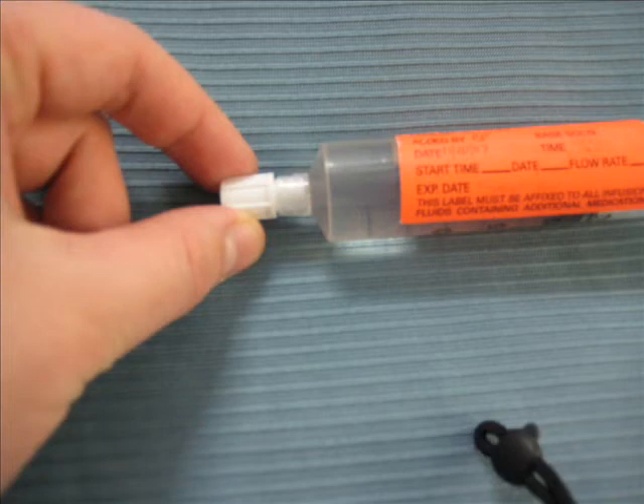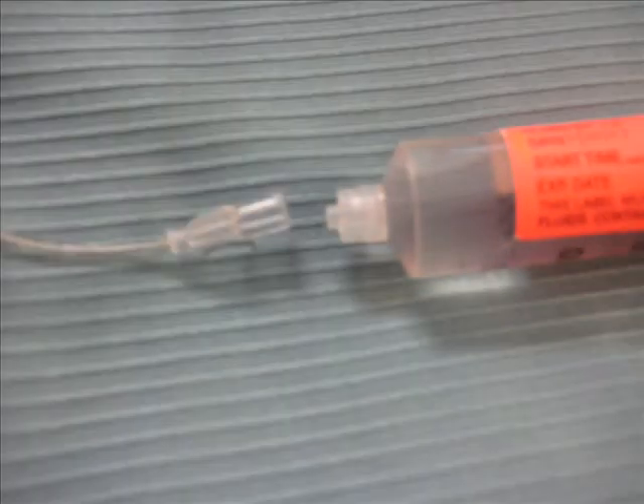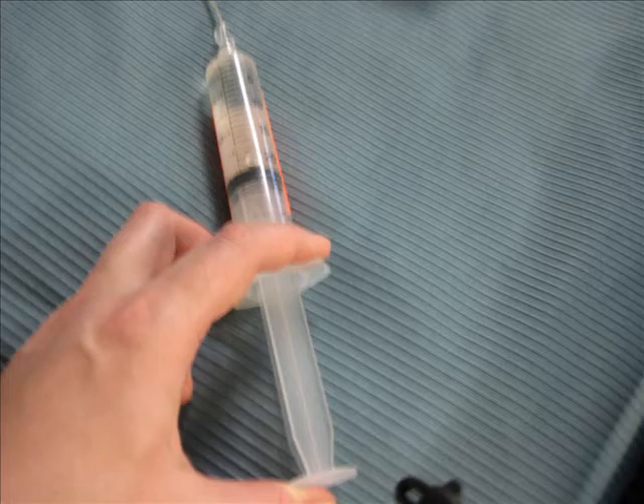First, take the cap off from your syringe where your medication is stored. Attach the line to the syringe using sterile technique — nothing can be touched except the sterile ports. When we attach the line to the syringe, we will flush it or prime it.